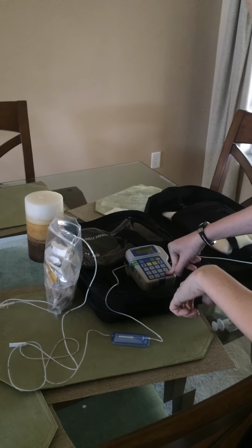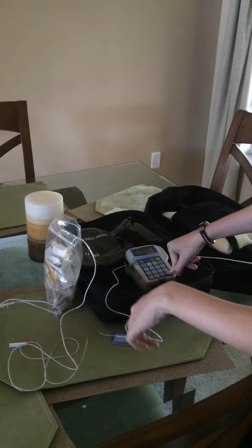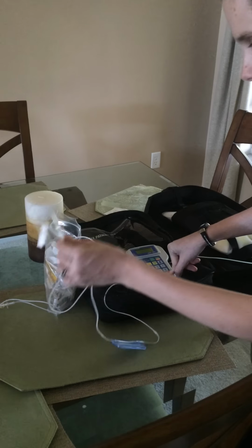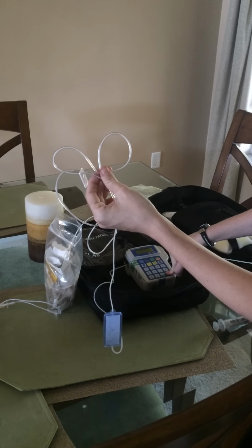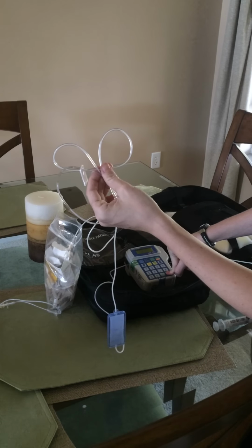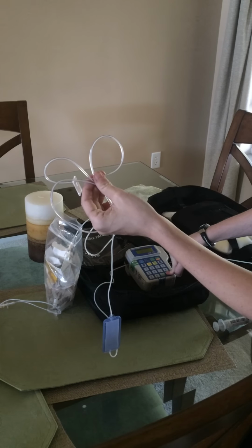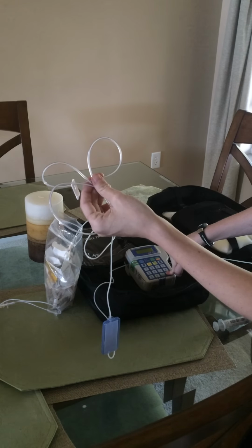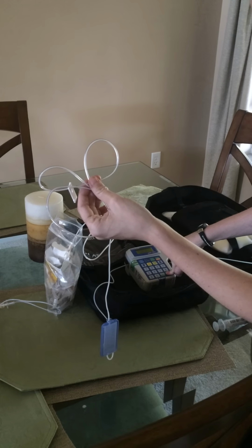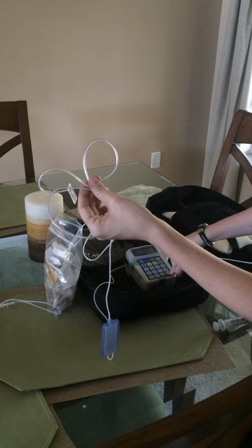and hold it down. And you can see all this stuff moving? At least I hope you can see. See all that air? I gotta get that all out of this bag. And still sometimes, even though I don't see any air, like 5 minutes later there'll be air coming out of nowhere and I have to hurry up and clip my line. I'm probably overreacting, but I don't want any air getting in through my line, so I clip it and pull out and flush and all that fun stuff.